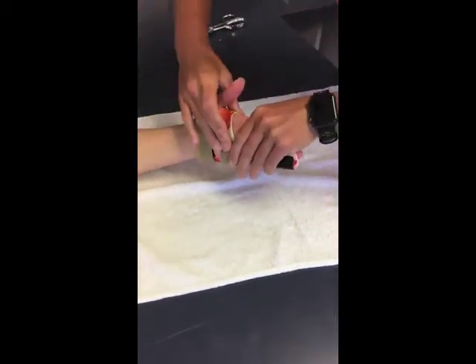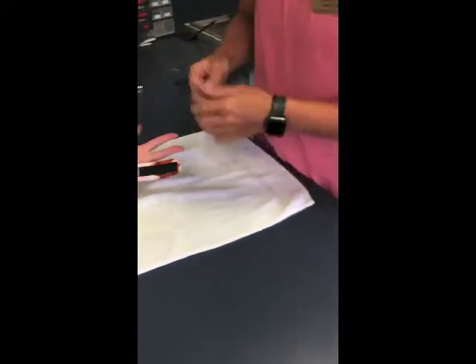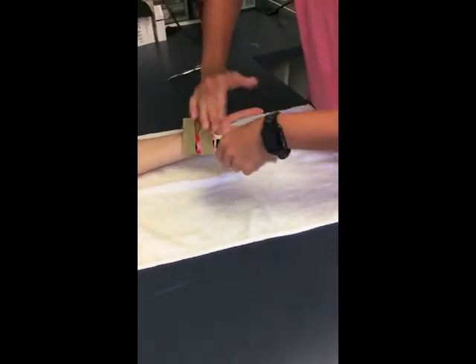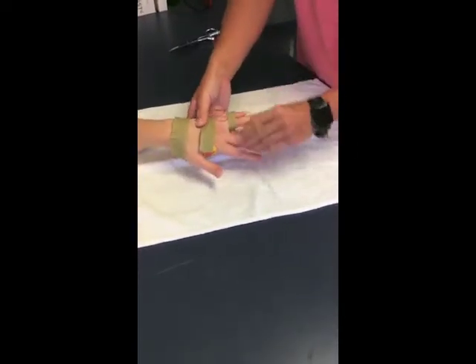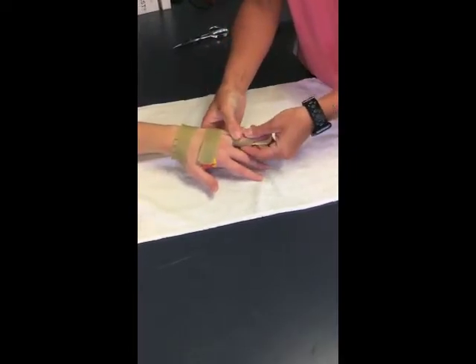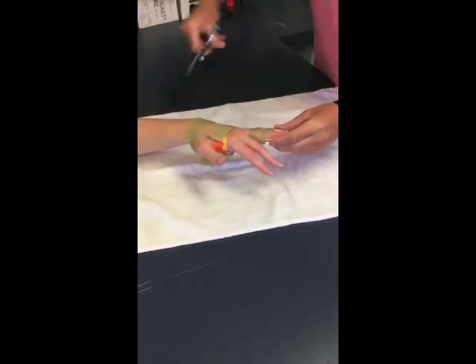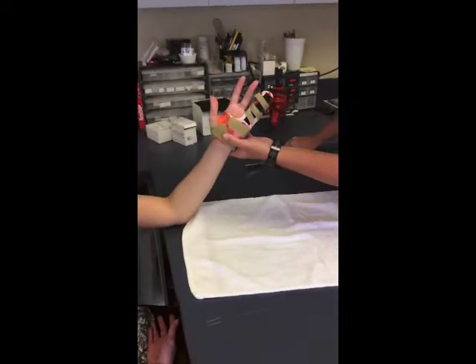You want to make sure it's pretty tight. And then this last part, I cut the large piece of velcro in half and I'm going to spiral it around her fingers so it's a little bit more comfortable. You can cut the excess off, have the patient move around, make sure it feels comfortable, and cut a little bit of excess down here as well.